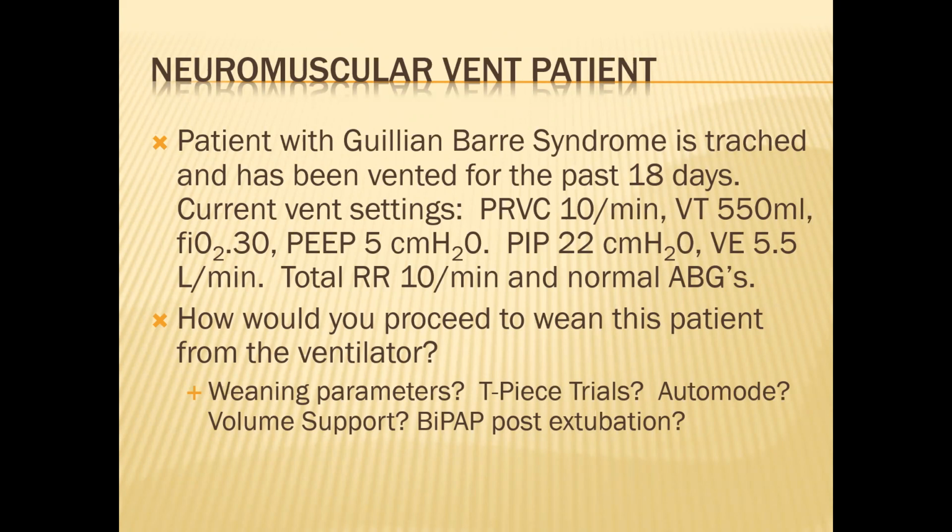And then volume support, is that a good idea? Giving different levels of pressure support to target a tidal volume? Okay, so let's say they're triggering spontaneous breaths.